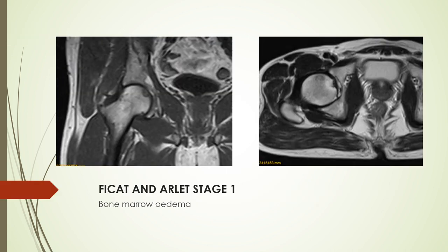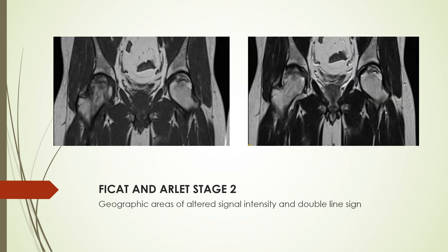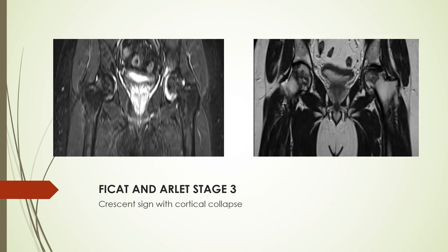In stage 1, there is bone marrow edema as we can see in this T1 coronal and T2 axial image. In stage 2, there are geographic areas of altered signal intensity and double line sign. In the left femoral head, we can see the double line sign in these T1 and T2 coronal images. In the right femoral head, we can see geographic areas of altered signal intensity with cortical collapse, where it has progressed to stage 3. In stage 3, there is a crescent sign with cortical collapse, as seen in this coronal STIR and T2 sequence in both femoral heads.